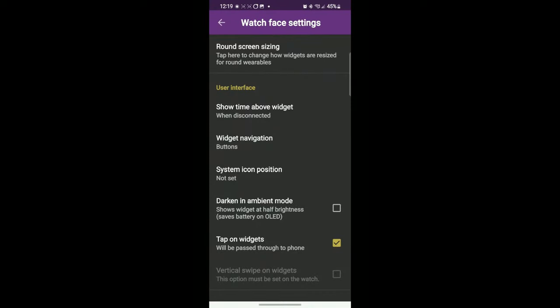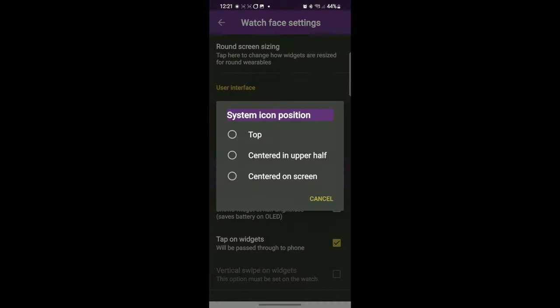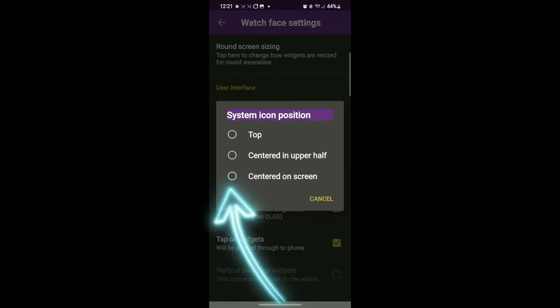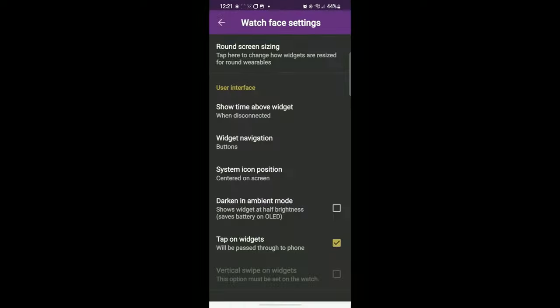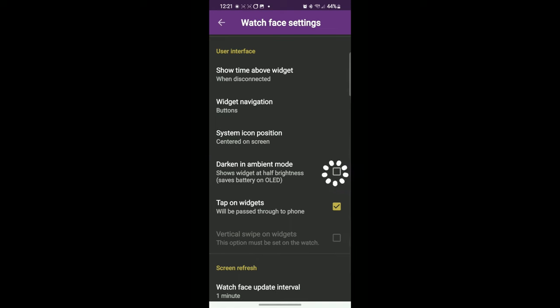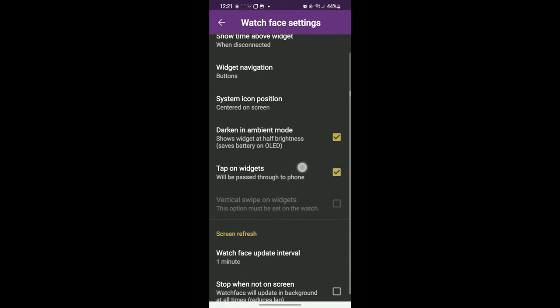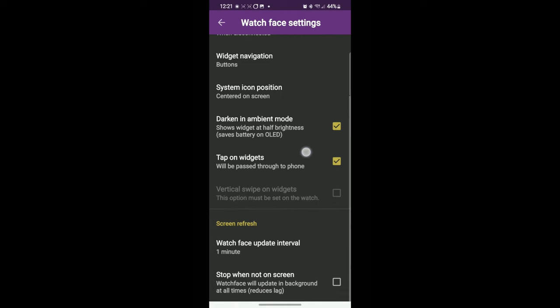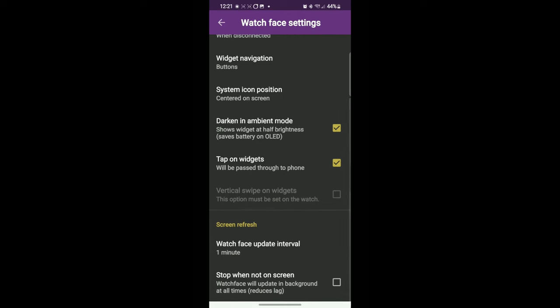And now we're at this screen. So what we want to do is system icon position. I want the icons to be centered. You can put it at the top, just whatever works for you. Darken in ambient mode, that'll save you battery. Tap on widgets will be passed through to the phone. Uncheck that one.